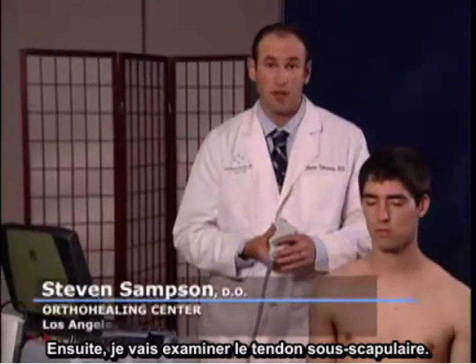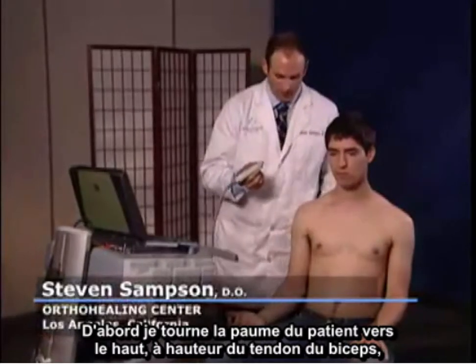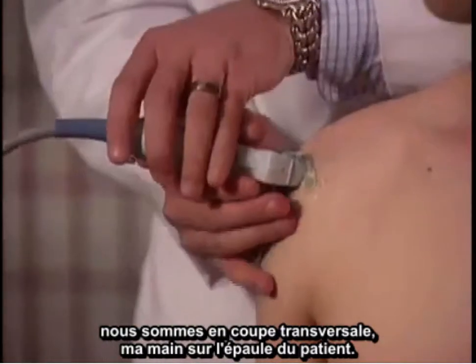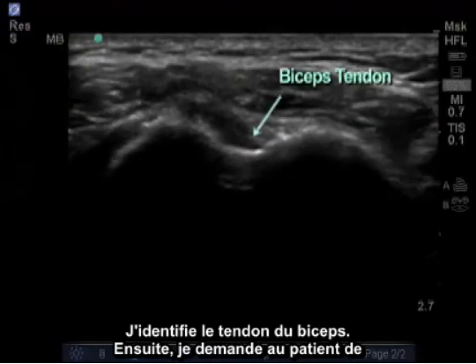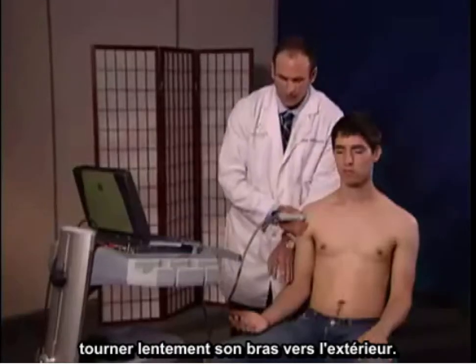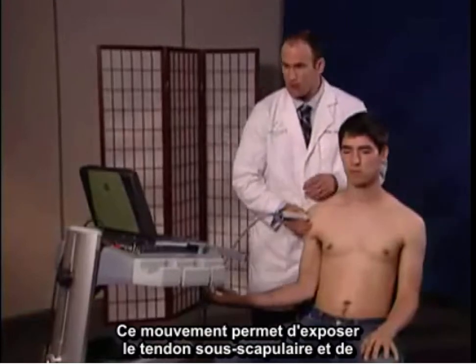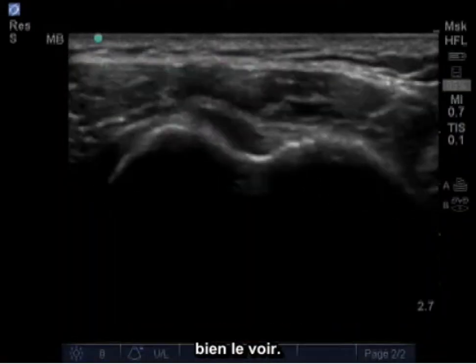Next, I'm going to examine the subscapularis tendon. I start with the patient with his palm up at the bicep tendon in the cross-sectional view, with my hand on the patient's shoulder. Identify the bicep tendon. Next, I'm going to have the patient slowly externally rotate his arm to the side. What this does is opens up the subscapularis tendon so we can clearly see it.